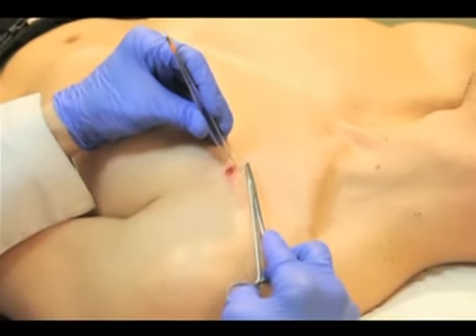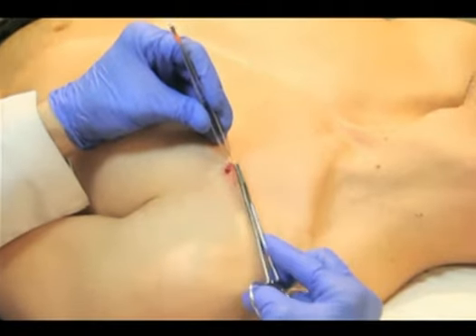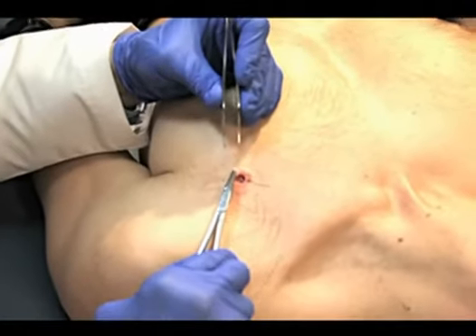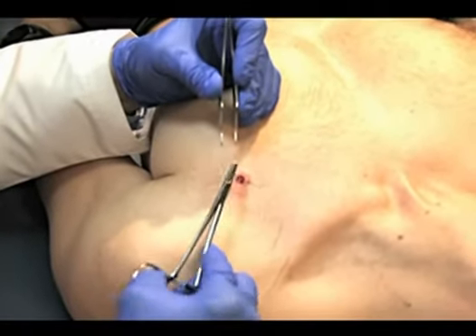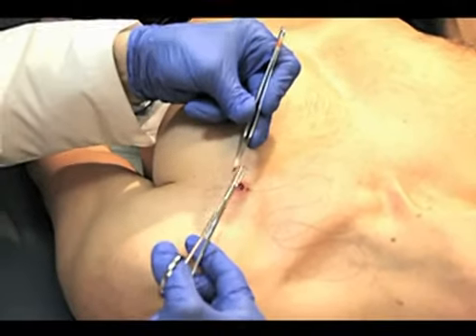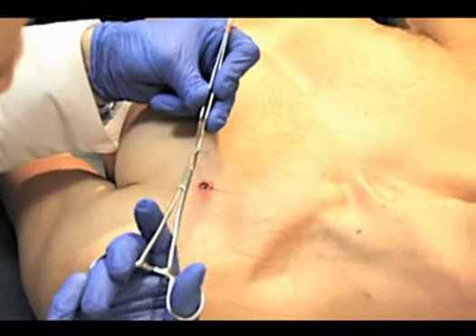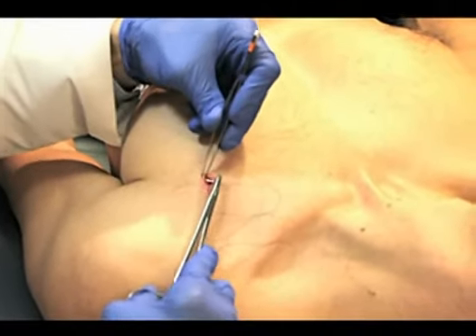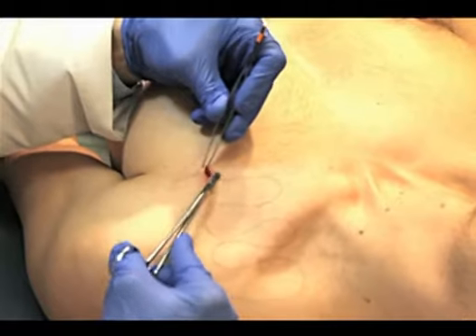Begin by placing the needle through the edge of the wound. Release the needle and, keeping your palm down, grasp the point with the needle driver. The wrist curves naturally, which directs the blunt end of the needle to your forceps. Reload the needle driver. Next, pierce the opposite edge of the wound with the suture.